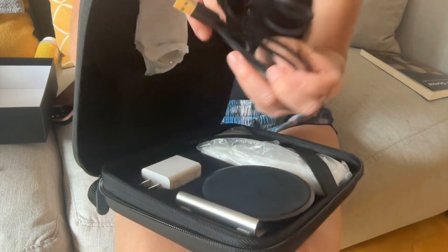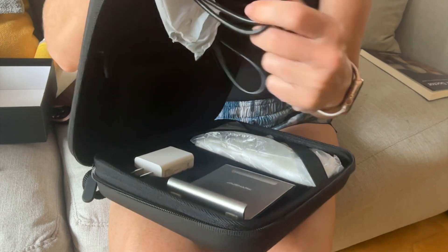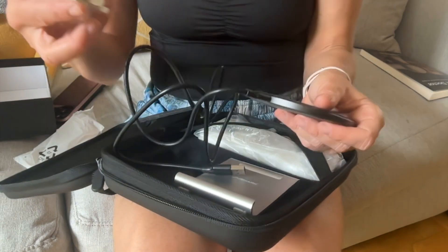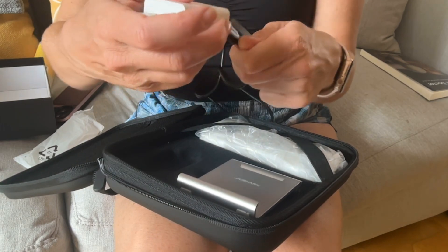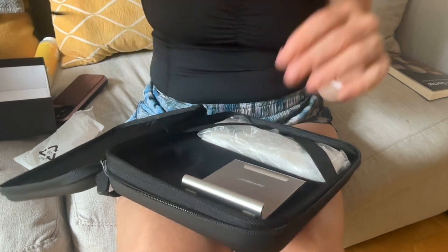We have our charger, which is wireless. You plug this in here — it's a USB-C connector. It comes with a wall outlet in the US, so this is the kind of connector I have. When we're ready to charge, we'll just lay the ultrasound on here and charge it.